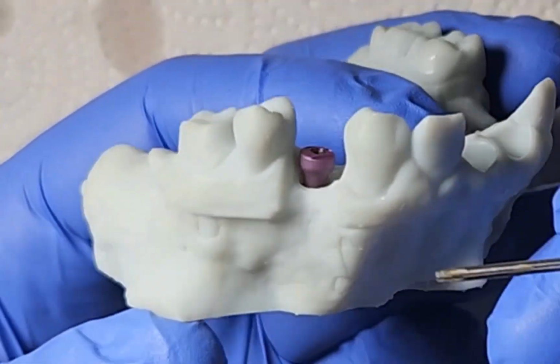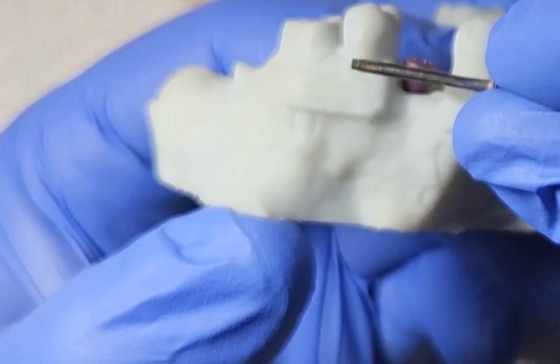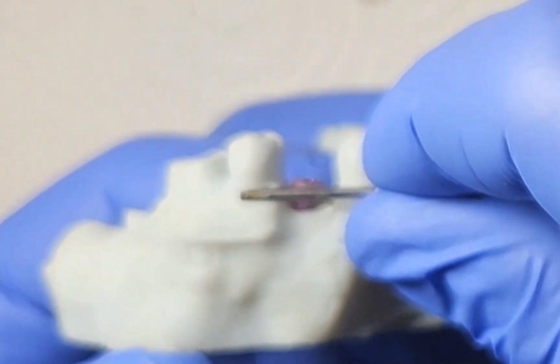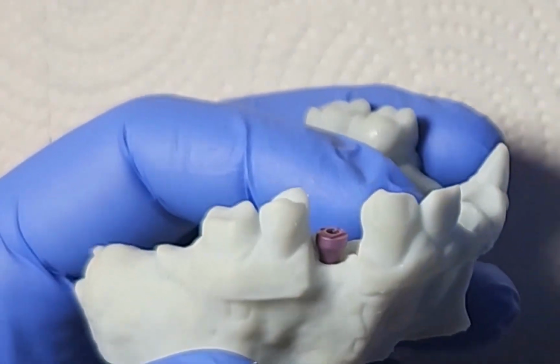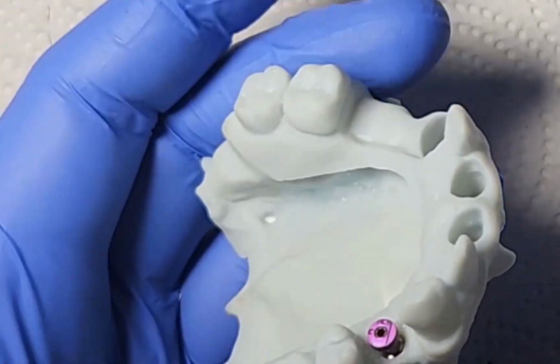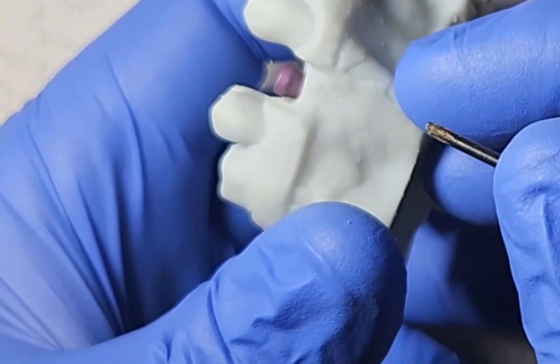So we've got our healing abutment in, and you want to place one that's going to just be above the level of the gingiva. That would be about ideal, as you can see right there. You don't want it sticking way up, and you don't want it so short that it's going to have the gingiva grow over the top of it. All right, so I'm going to go and scan this now.